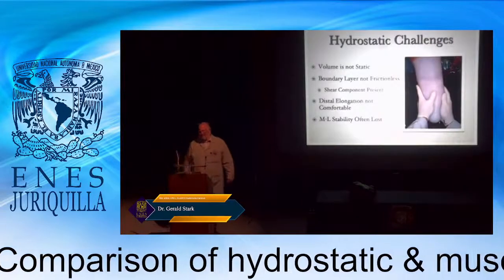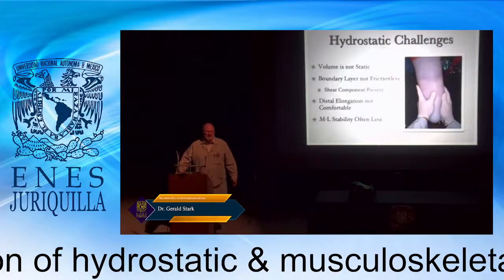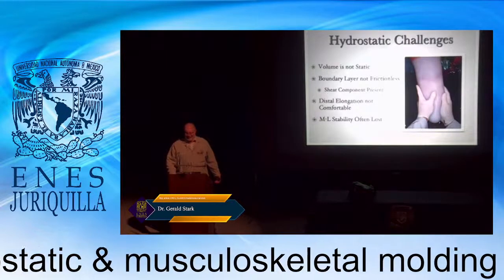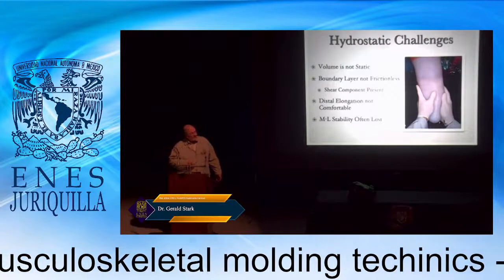The hydrostatic challenges, though, are very simple. Because we're dealing with diabetic patients, are they prone to volume change? They're prone to a lot of volume change. And so the other part is their skin is not necessarily frictionless.